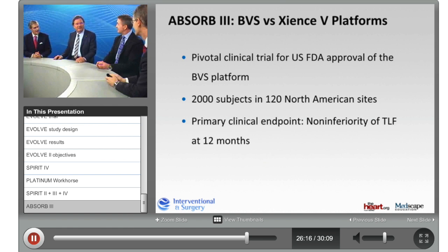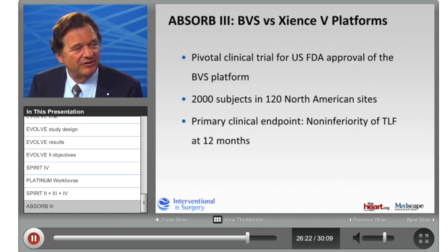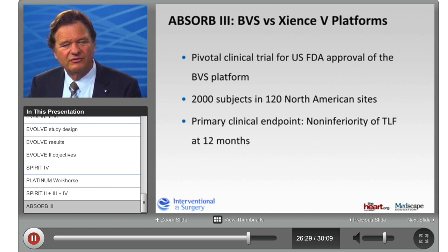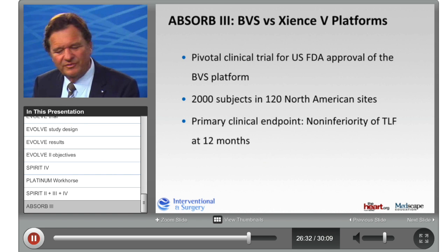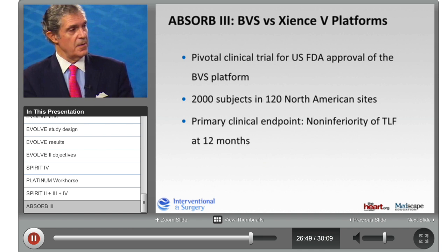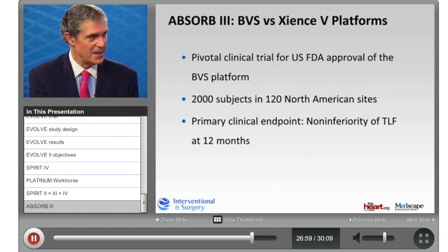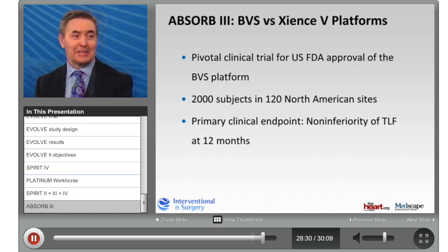But before it's proven, actually, I think I'm the only one who can use it today, because the Absorb stent is CE marked, so it's available. Abbott sells it already. We have to go through an official training course just to make sure it's not used in too calcified lesions and not with too much torque, with too many bends around the vessels. But it's going to be a very, very interesting thing. The only problem is the price. The price is much higher than the average drug-eluting stent, and we have to see if the healthcare providers will take over. And very frankly, the target for Absorb 4 was superiority from 1 to 5 years. That's been out; this is public knowledge. But the point there is 2.6% TLF per year. Can you beat that? So less is more, is what I would say.